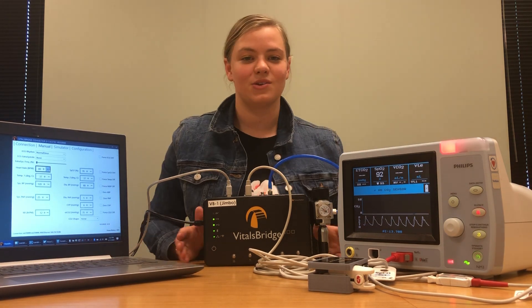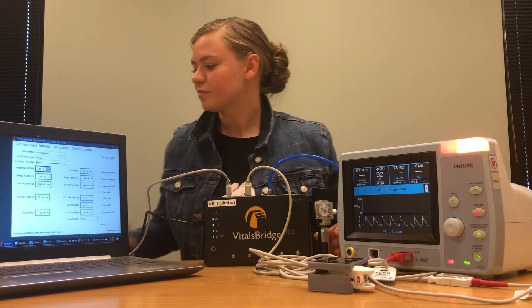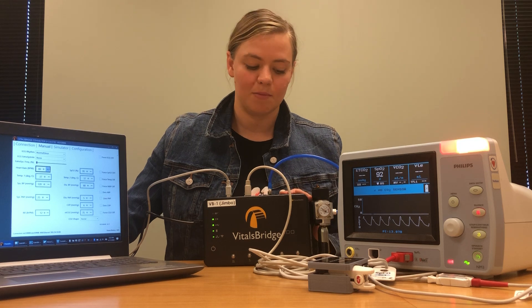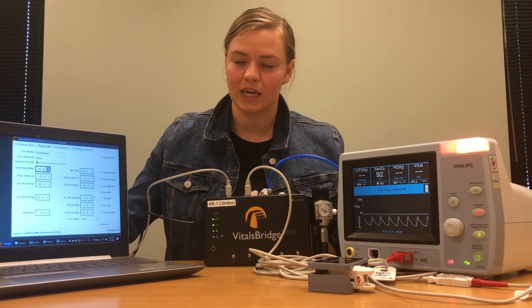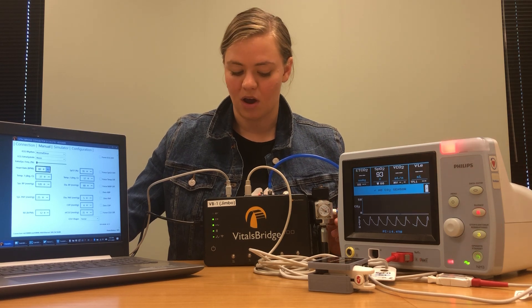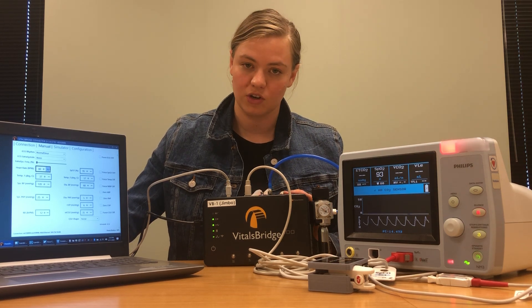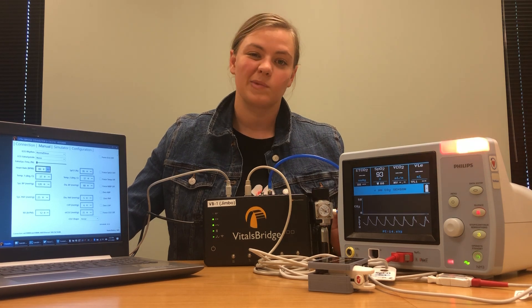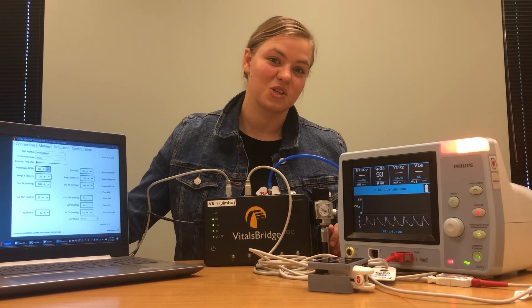And we can move on to connecting our carbon dioxide. This VitalsBridge has been configured to work with a mainstream capnography machine, which is what we're going to be connecting today. However, a lot of machines do use sidestream capnography. The VitalsBridge can be configured to work with sidestream capnography. For help on how to configure that, please contact support at vitalsbridge.com.